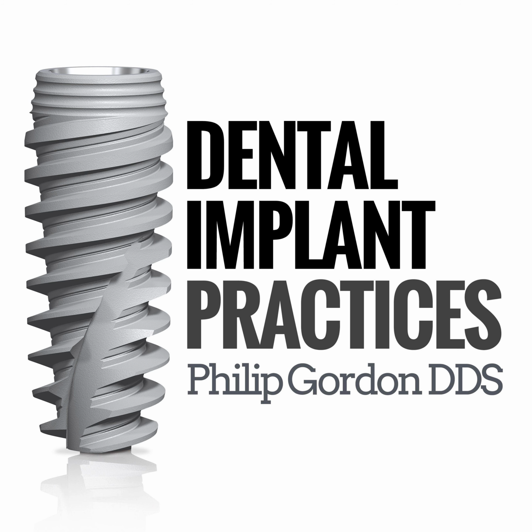And what you do then is if in some of those areas where you want to place an implant, the bone is not adequate, it's not wide enough, it's not high enough, you know that ahead of time. So rather than getting in surgery and saying, okay, what do I do now? All the variables are known ahead of time and you plan for them. And so once you realize that you need to augment the bone, you need to widen the ridge, you're aware of those issues ahead of time and you plan for it. So rather than placing the implant where the bone dictates, you're placing the implant where the prosthesis dictates and developing the site so that the implants are in the right place.